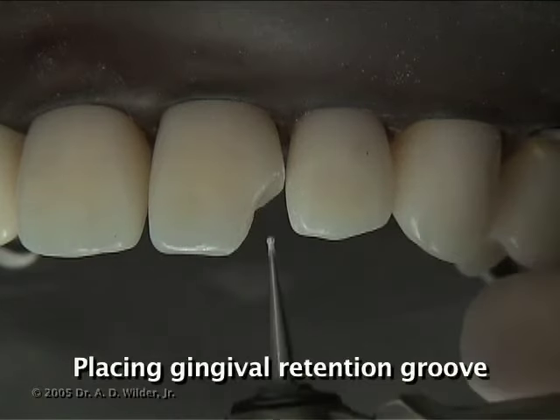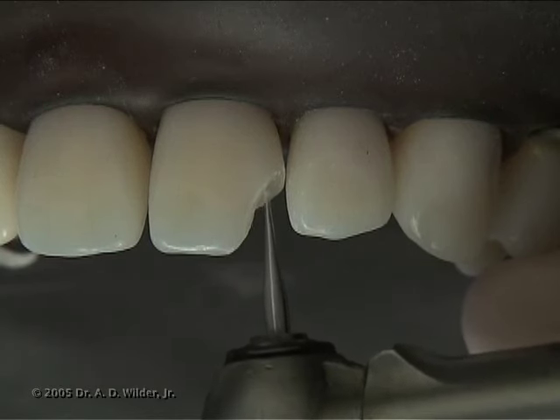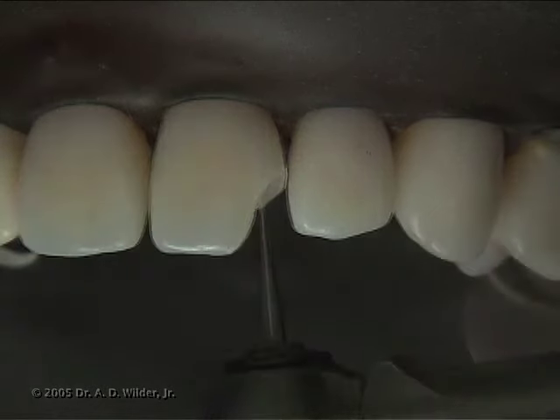A gingival retention groove is generally recommended to provide resistance to proximal displacement of the restoration. This is usually done with a small quarter-round bur used to create a shallow 0.25mm groove just inside the dentin-enamel junction.